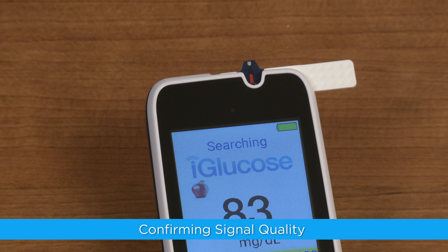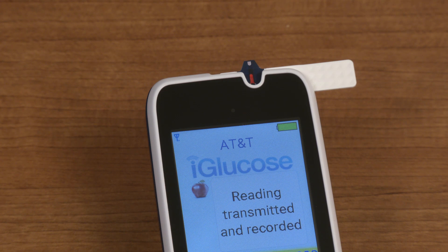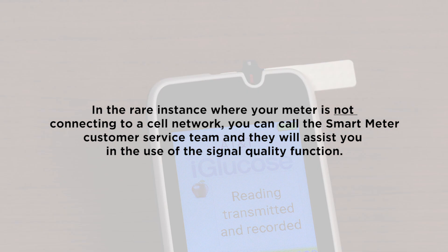Confirming signal quality. The iGlucose meter is a cellular device. Each time you perform a blood glucose test, the meter will automatically connect to the cellular network and transmit your test result to your healthcare provider or care team. In the rare instance where your meter is not connecting to a cell network, you can call the Smart Meter customer service team and they will assist you in the use of the signal quality function.